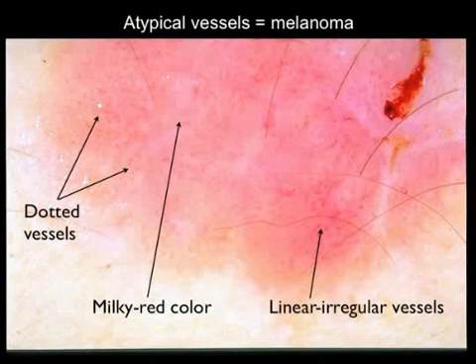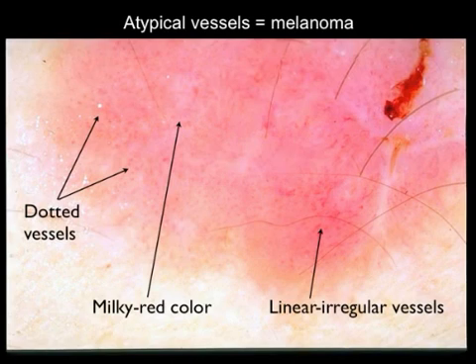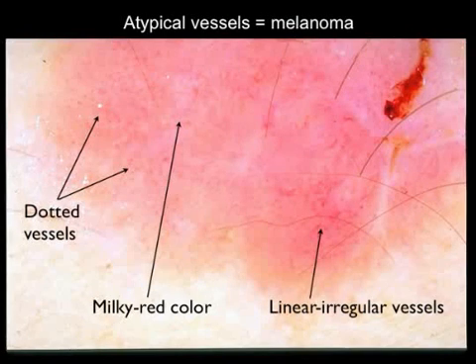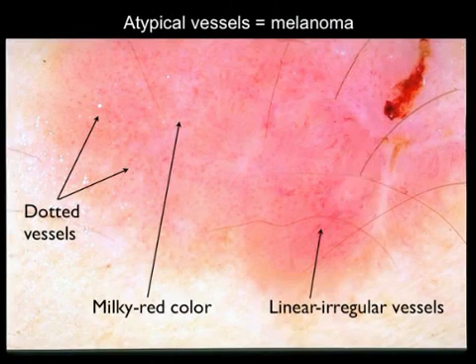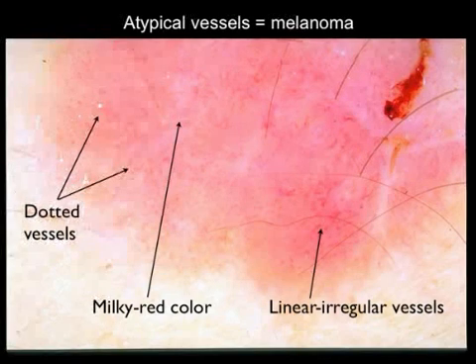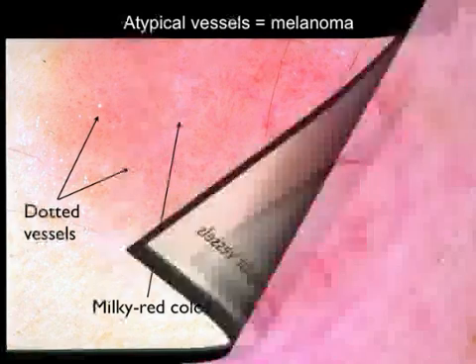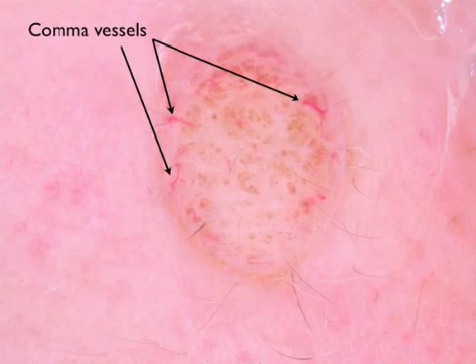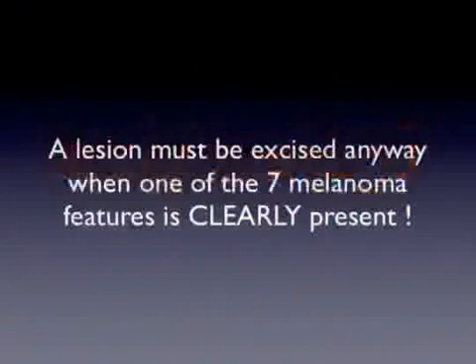Atypical vessels are the last but not least melanoma-specific criterion. They are represented by dotted vessels, linear irregular vessels, or a combination of both, usually lying on a background of milky-red coloration. Atypical vessels are not easily found in heavily pigmented melanomas, but they can be the only valuable feature in hypomelanotic and amelanotic melanomas. Atypical vessels should not be confused with the typical arborizing vessels of basal cell carcinoma, like the example here, and should be differentiated from comma vessels, typically found in globular congenital nevi, as is the case here.